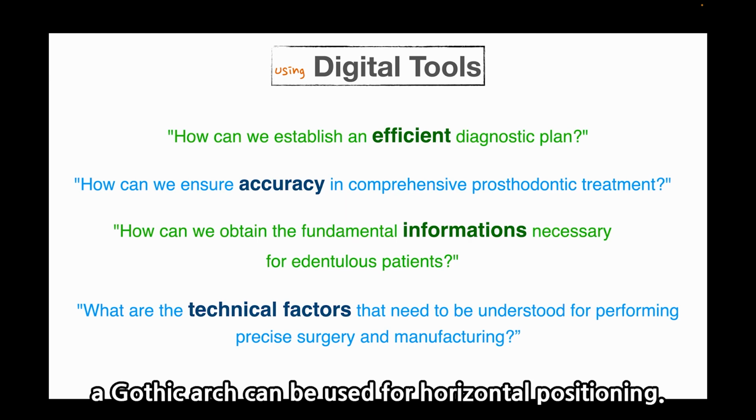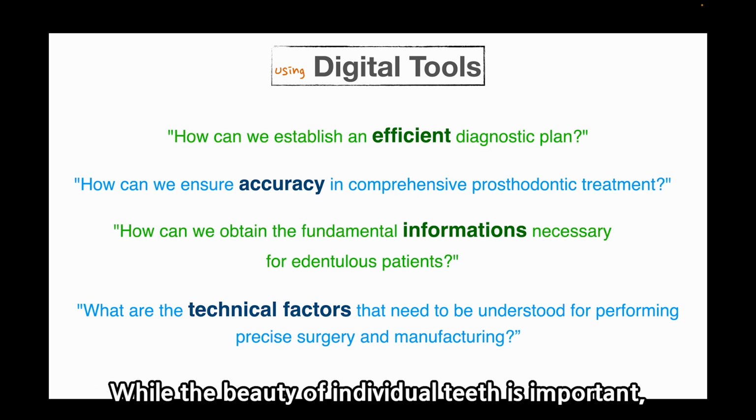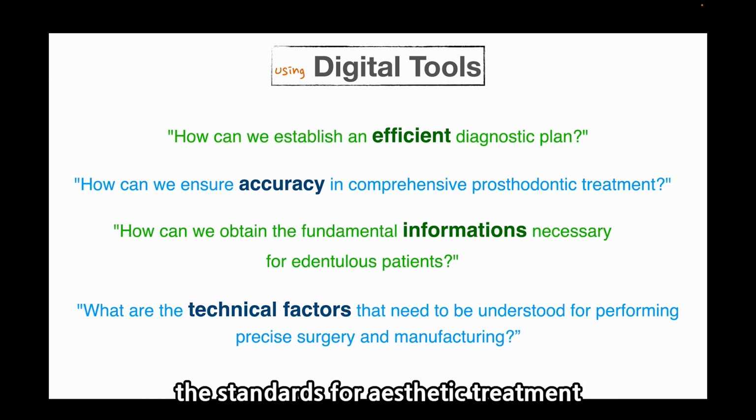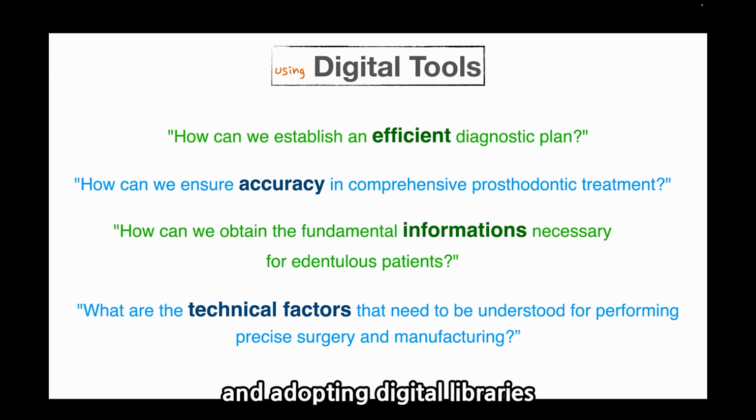Gothic arch can be used for horizontal positioning, while the beauty of individual teeth is important. We can pursue efficiency by understanding the standards for aesthetic treatment and adopting digital libraries that reflect these standards well.